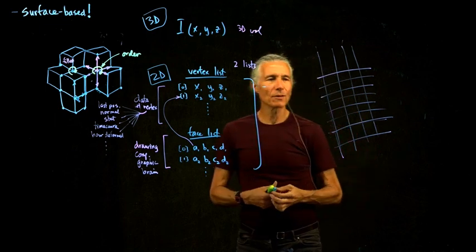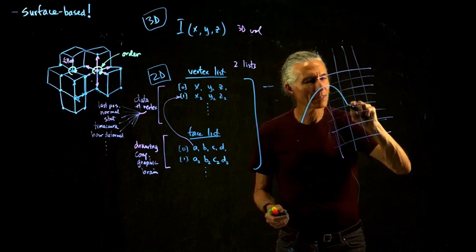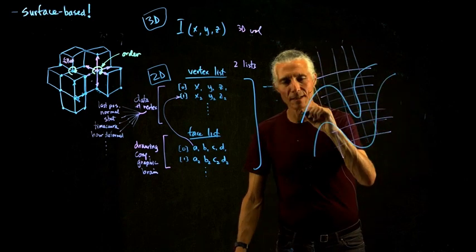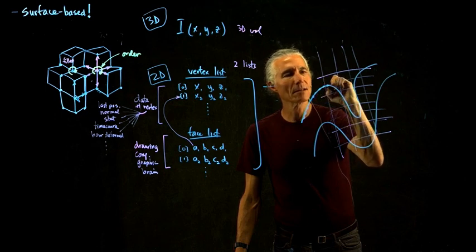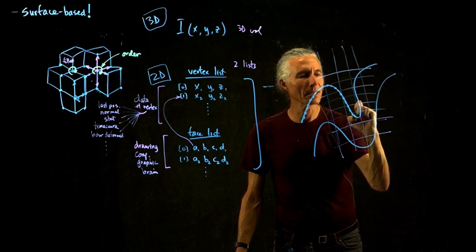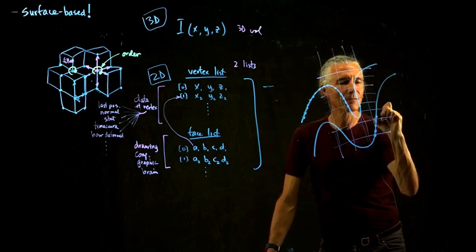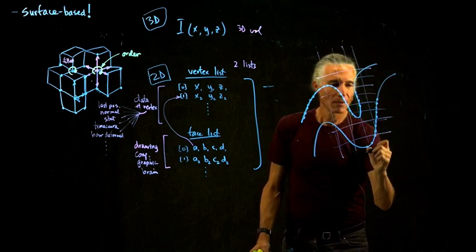So how do we get it onto the surface? So now here's the surface. Now the surface doesn't have the same resolution as the 3D data set, so it might typically be finer. Here are all the vertices on the surface. So how do we get the data onto the vertices? And then here's another surface. This is like the gray-white matter surface. So how might we get that on there?